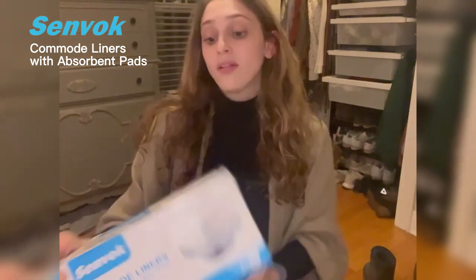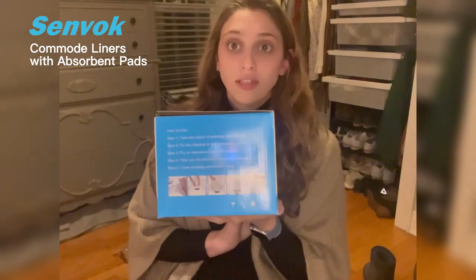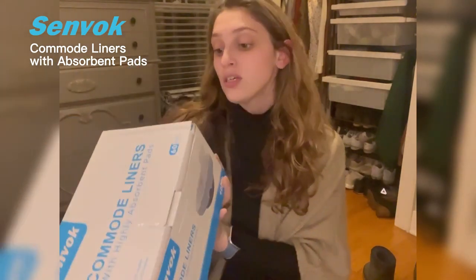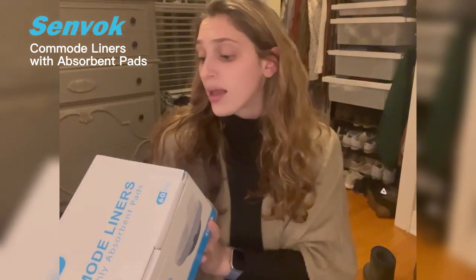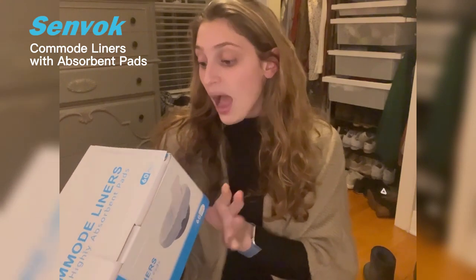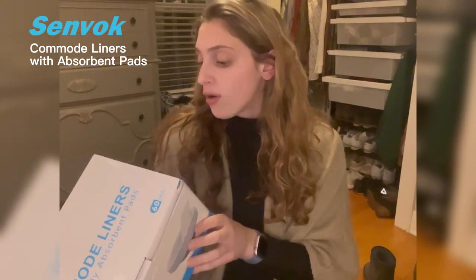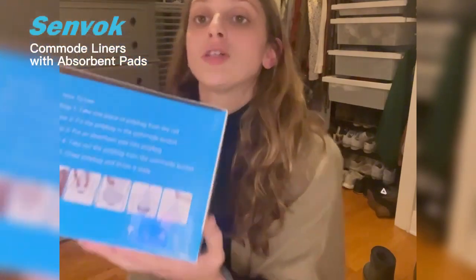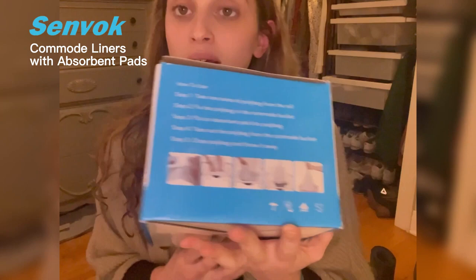I love these specifically because of how nice the box is, and I like that on the side it gives you directions on how to use. First, take one piece of a polybag from the roll. Fix the polybag in the commode bucket, put the absorbent pad into the polybag, take out the polybag from the commode bucket, and close the polybag and throw it away. It also shows you pictures on the side so you can see exactly how it works.